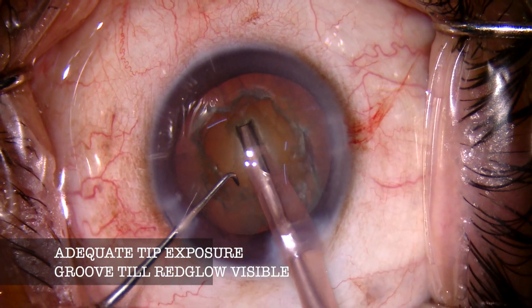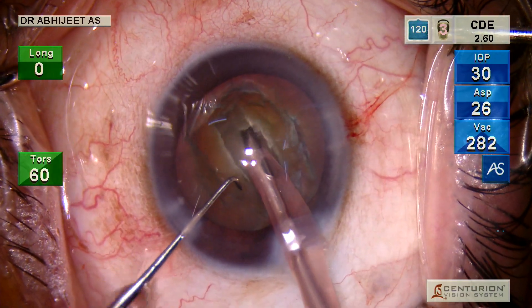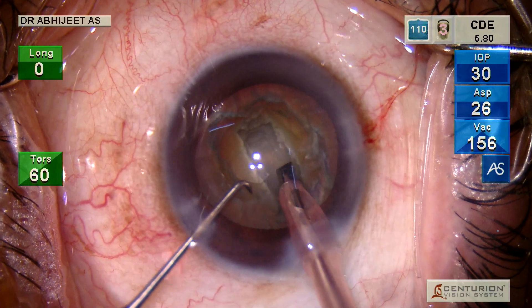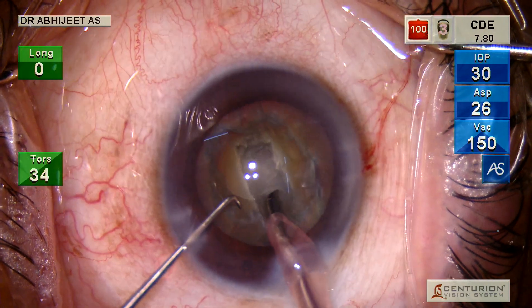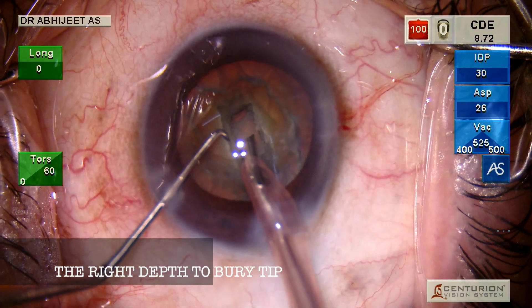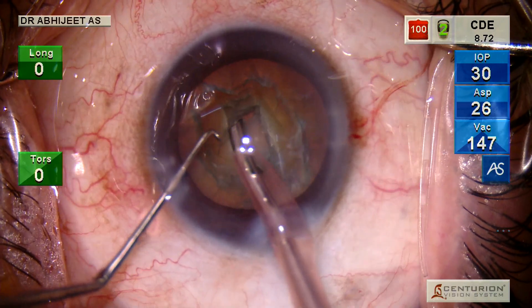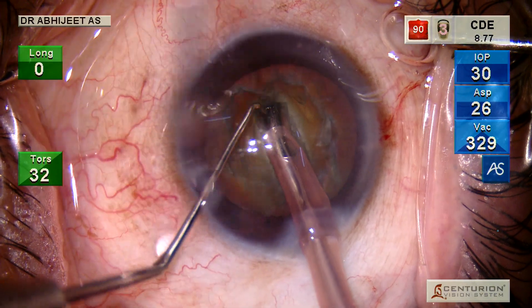Once you've cleared the superficial loose cortex, we start trenching. I make a bigger highway so that my tip can go in easily. It's a grade 4 nucleus sclerosis. Here I am showing the exact place where you have to bury the tip — not superficially; it has to be in the deep, harder part of the nucleus.